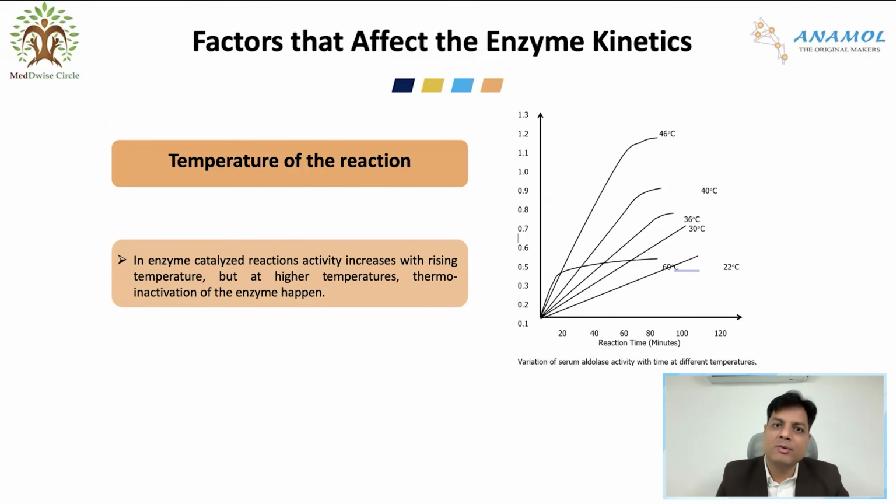Now, hypothetically, if our flow cell is not maintaining 37 degrees Celsius, will the enzyme show maximum activity? The answer is no. When the enzyme is not showing maximum activity, obviously the amount of product that was originally supposed to be formed per minute will not be achieved, and less product will be formed per minute. This will lead to a wrong result because we will think that the enzyme is not functioning properly, but the enzyme is functioning properly; we have only not maintained the temperature.